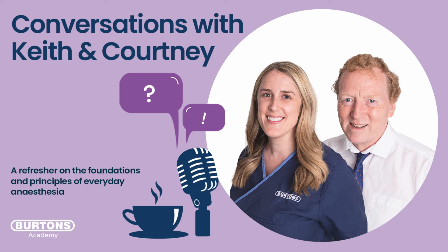And then we start to see, as the alveoli start to empty, a slow rise. And that's our phase 2 then. We're starting to see a rise in CO2. And then we get a mixing of all those different regions of the lung until we get proper alveolar gas coming out, which we move into phase 3. And that's our plateau, a gently sloping plateau to the end point where we start phase 0 again.